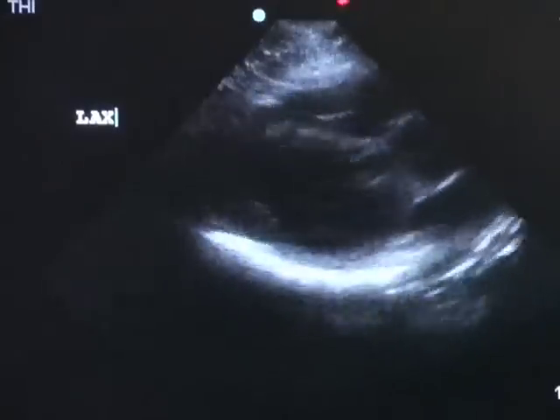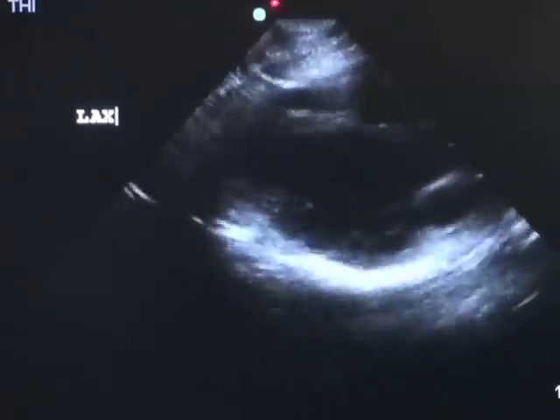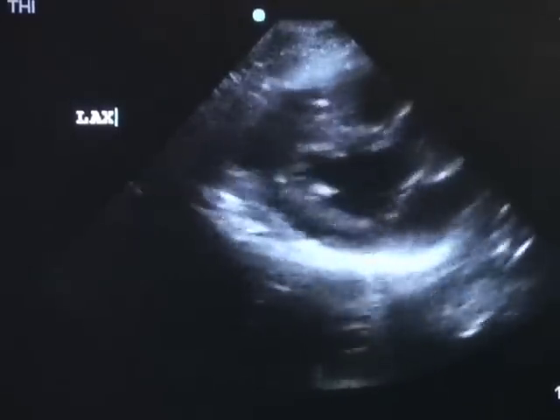We're in the cardiac setting. Dr. Kuby has set it for the cardiac application, using the phased array probe, the P21, with a footprint of 21 millimeters. She's in the cardiac setting, but we're using the leading edge, that is, the mark is on the left side of the screen. We are pointing toward the left hip for the long axis.